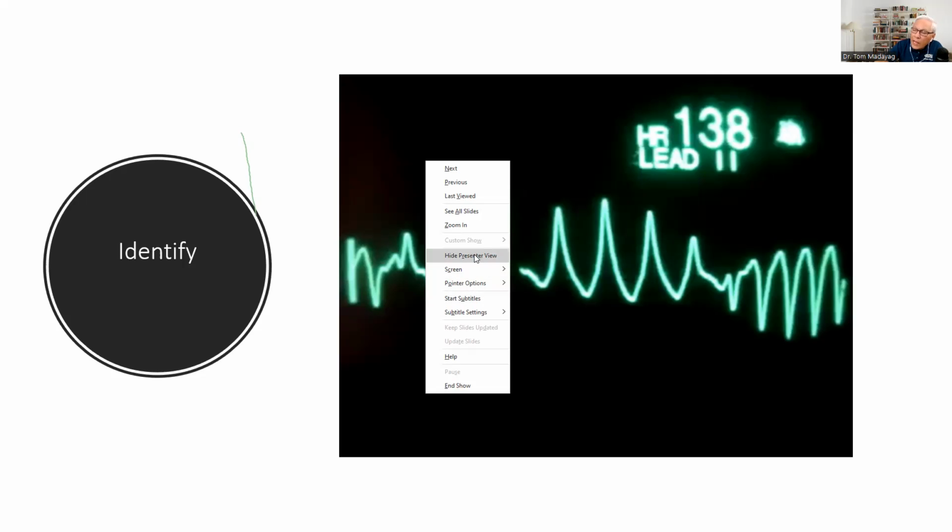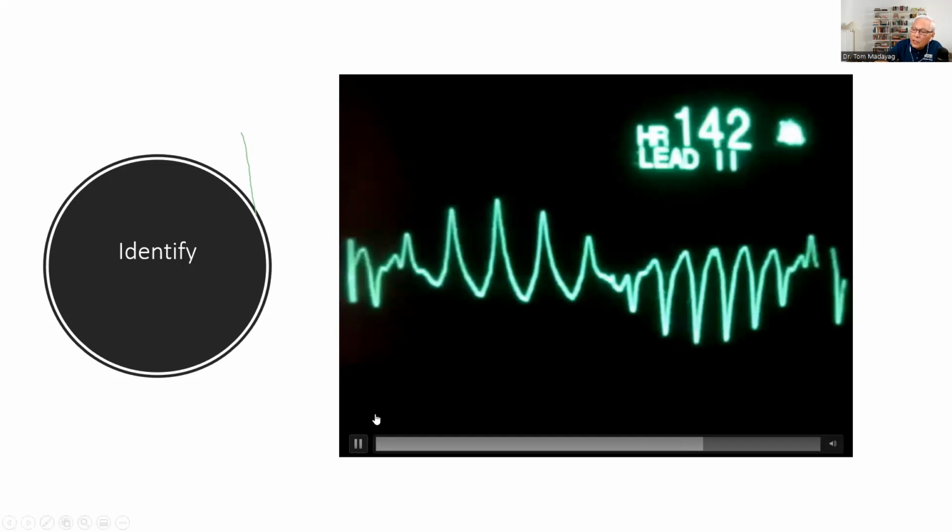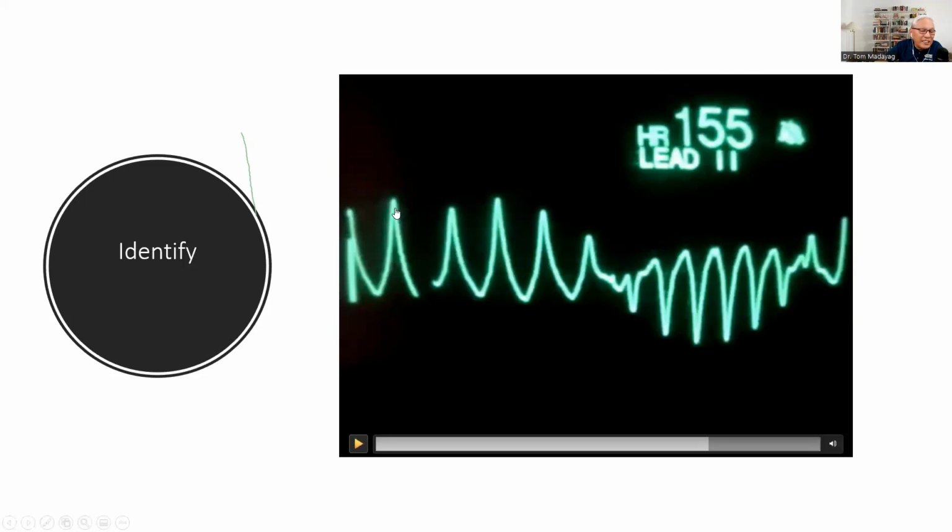The reason why we do not cardiovert is that cardioversion detects the QRS complexes. Cardioversion is not going to be possible in this situation because of the polymorphic characteristics of the QRS complex. Sometimes it would sense this, sometimes it would not, because the QRS complexes are pointing in different directions.